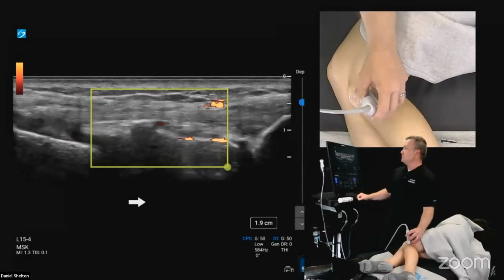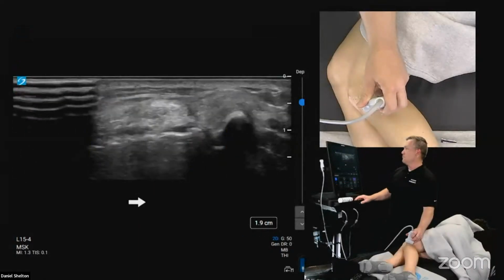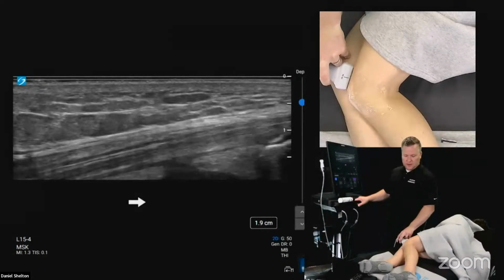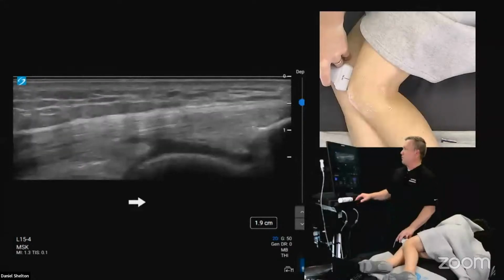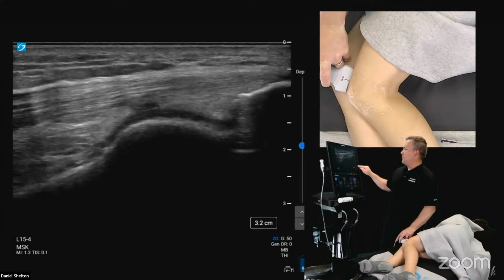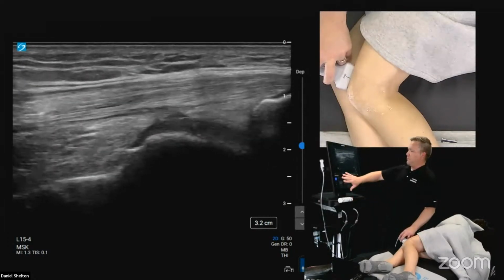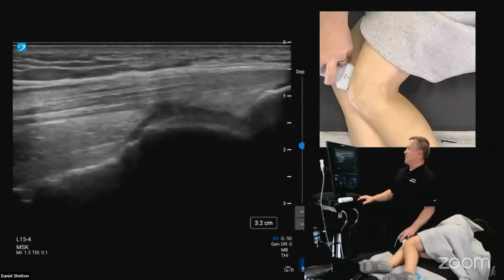First question is, this may not be specific to medial lateral scanning, but is there a mechanism to assess for synovial swelling or thickening at the knee joint? Yeah, typically the suprapatellar recess is your first giveaway, and given that her knee is already in this kind of position, you can see a nice lateral shot this way. So we would check the suprapatellar recess for simple effusion versus synovitis here. I'm going to drag the depth button down, or we can even use the buttons here at the bottom. This is an all touchscreen display, so if you're used to the PX or the LX, we've taken your user interface and put it into a touch platform with the buttons in the middle for save image freeze. So you're going to see me press a different spot of the screen.